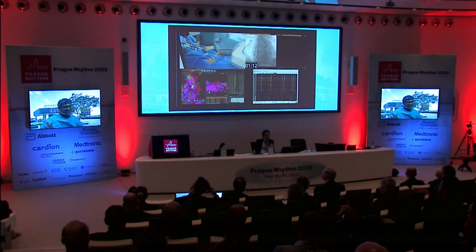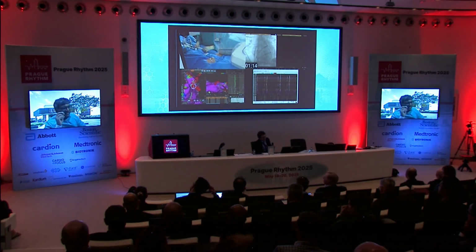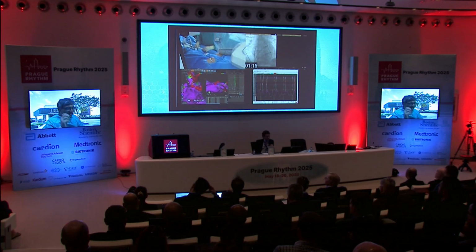I can only tell you what I know, which is the whole pulse is QRS synchronized, and it's delivered in less than 200 milliseconds. It's so quick. I mean, that's it, right? It's like a snap of a finger.